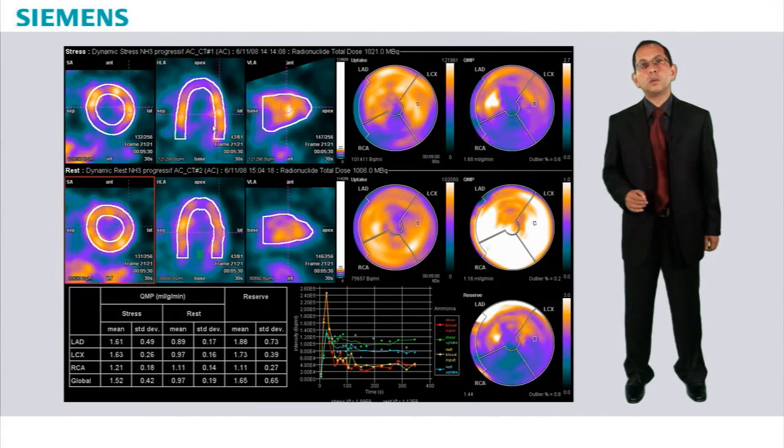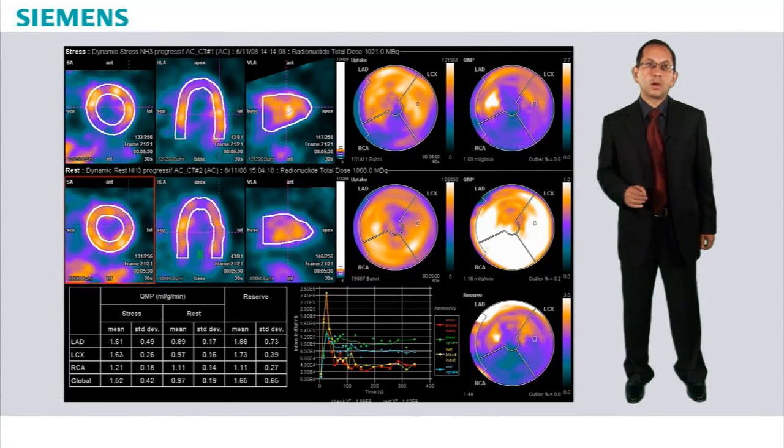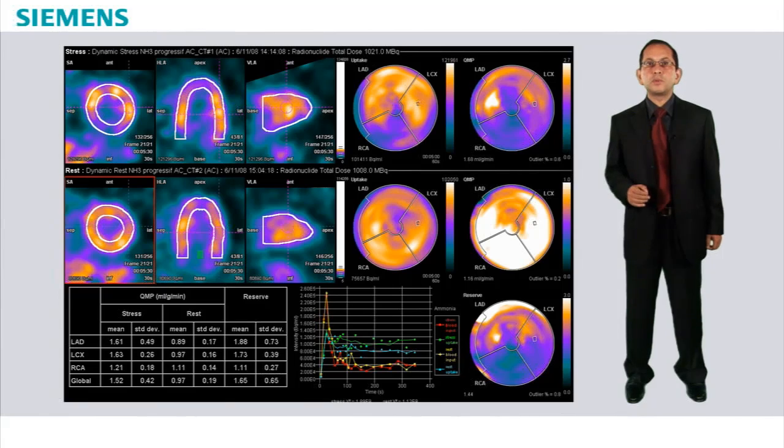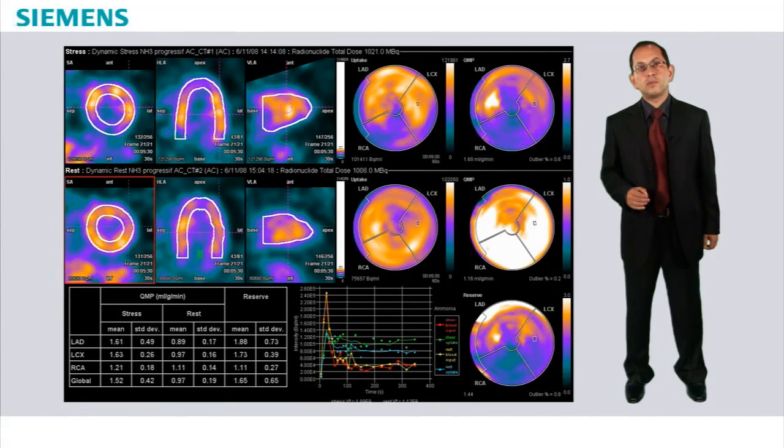Cross hairs indicate the location of the corresponding areas in the short axis, horizontal long axis, and vertical long axis views. This is how we obtain flow for both peak stress and rest, and calculate the corresponding coronary flow reserve for a quantitative evaluation of myocardial blood flow.